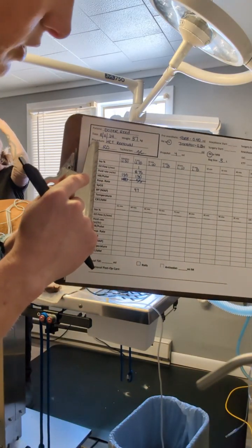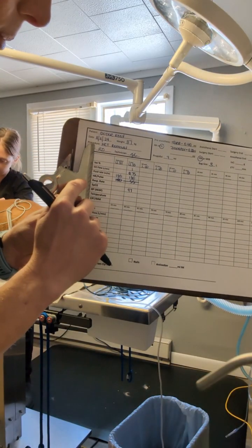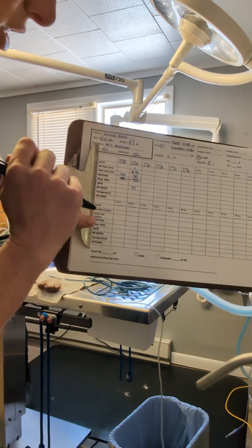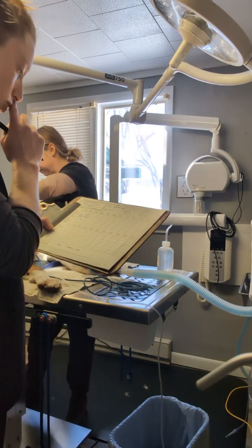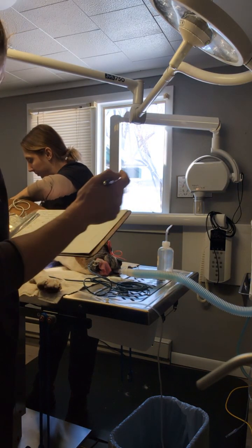So we have all of our values to the left: percent ISO, O2 flow, fluid rate, heart rate, pulse, respiration rate, SpO2, blood pressure, temperature, and CRT, capillary refill time, and mucous membranes. So I'm just going to go through all the values that my pulse oximeter is showing me and fill in everything that it gives me.